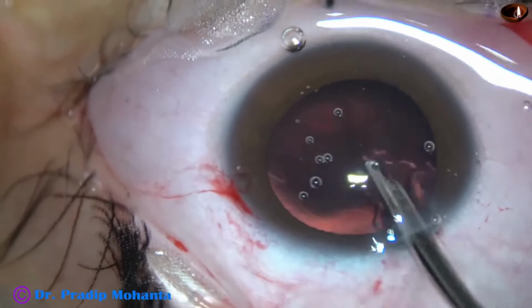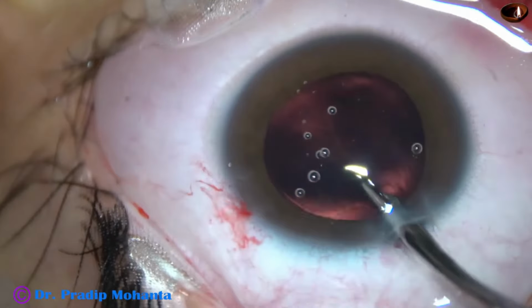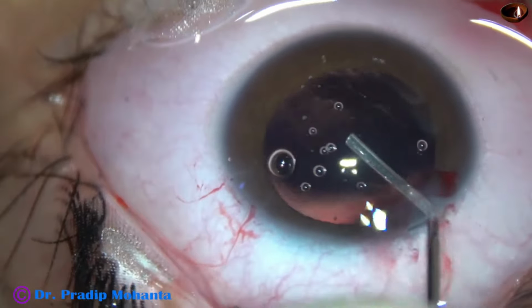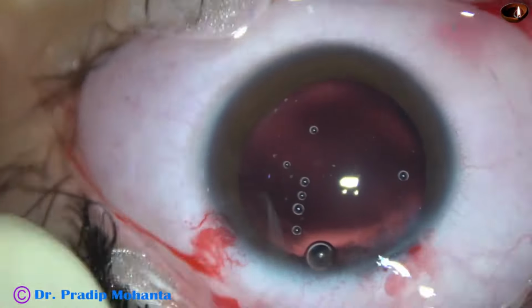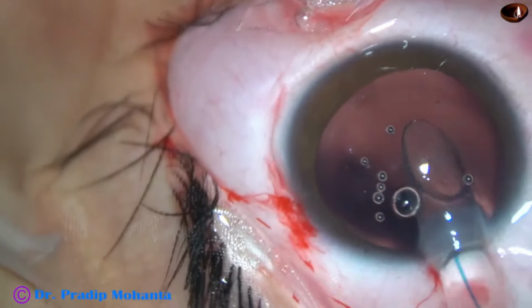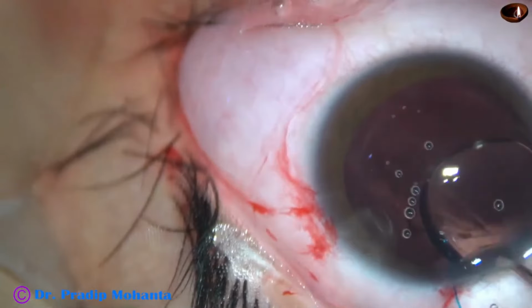I have selected the three-piece intraocular lens because the haptics support the equator of the capsular bag better. The haptics of the three-piece intraocular lens support the equator of the capsular bag much better than single-piece intraocular lenses. The cartridge that I'm going to use will not go through the 2.8 mm wound, so I've enlarged the wound to about 3.1 mm. Now here goes the cartridge, and the leading haptic is going into the capsular bag. This is a three-piece intraocular lens.